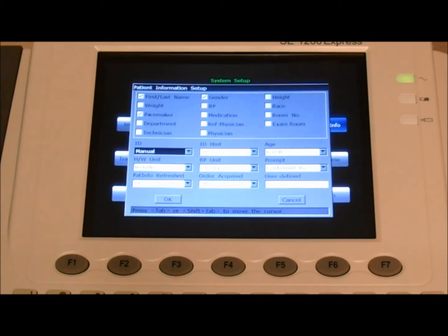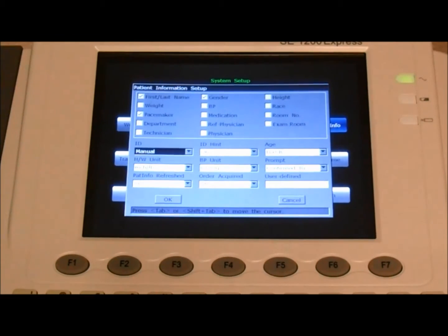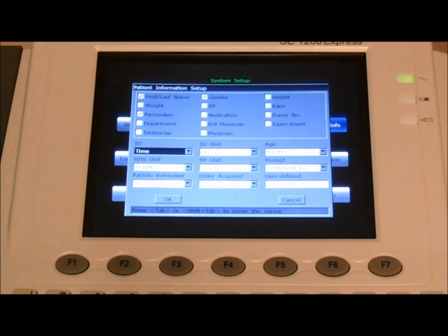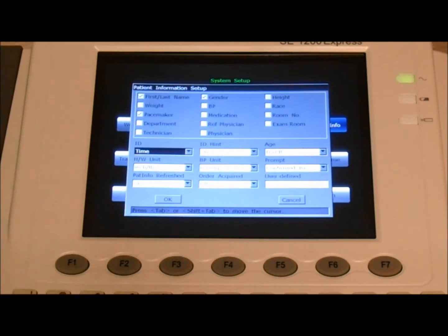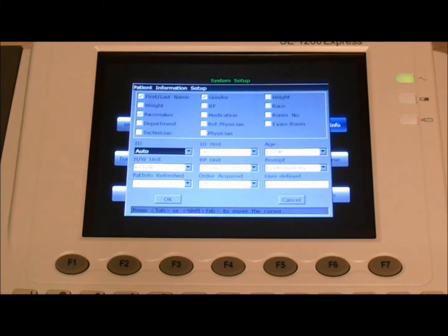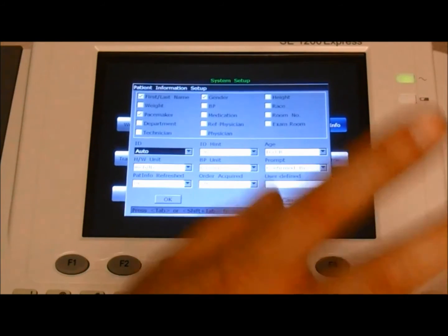Manual, where the operator needs to manually enter the ID for every patient. And time, where the ID is generated automatically according to the time and date. So right now, we'll set it to auto.